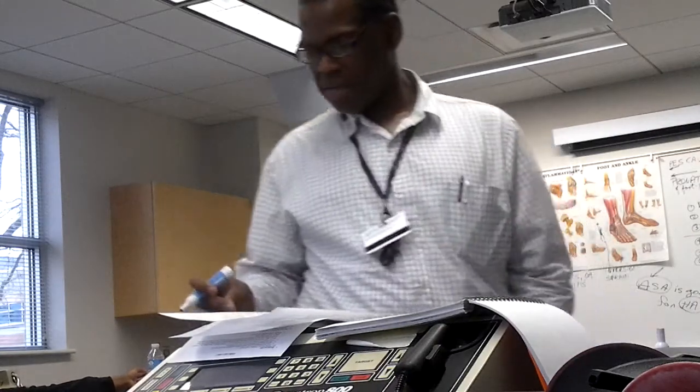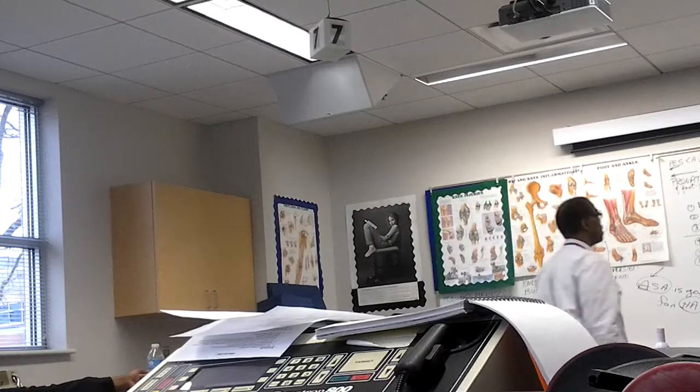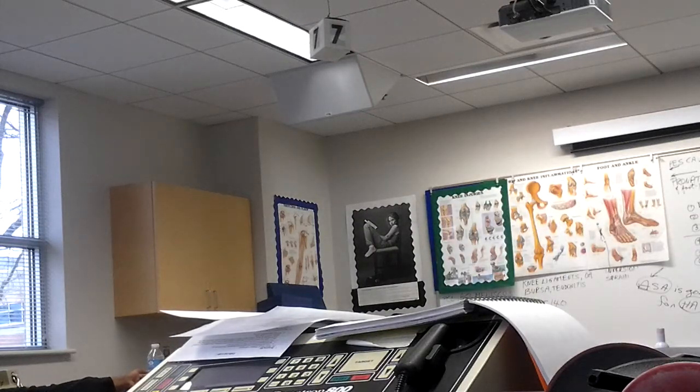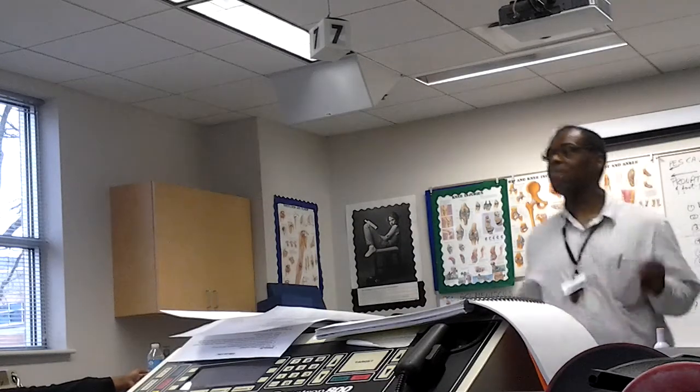Now, if same size pads with different intensity, it goes to the higher intensity. So if for whatever reason that's channel 2, for example, then it's going to go back and forth within that channel level.